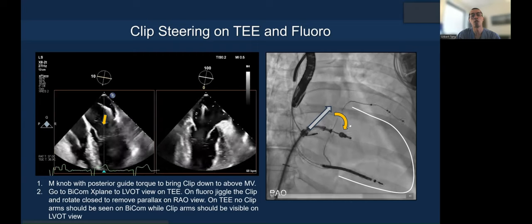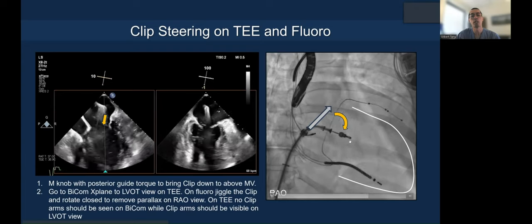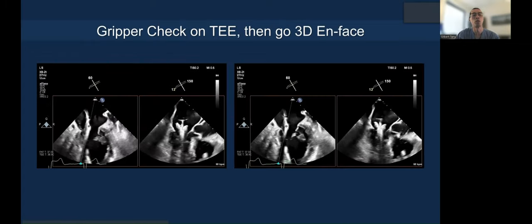On fluoroscopy, you're aiming with posterior guide knob and trying to land the clip in the correct position. After that, you jiggle to take the parallax out of the clip and also to loosen the tension in the system.